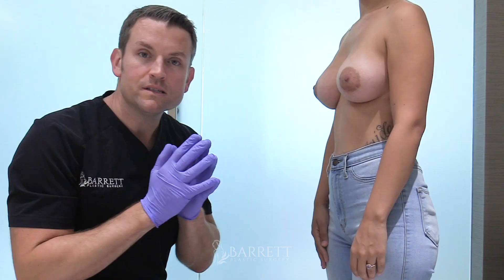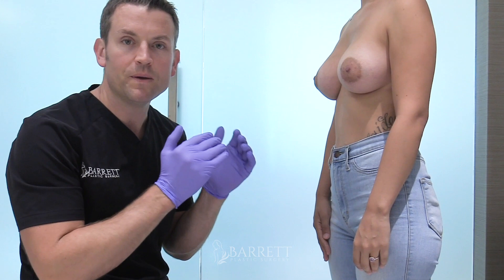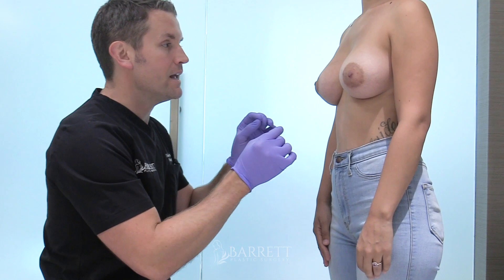Hey everyone, this is Dr. Barrett. I want to show you this quick video on how to massage your breast implants. Our patient has bilateral smooth moderate profile plus silicone implants and she's now six months post-op.